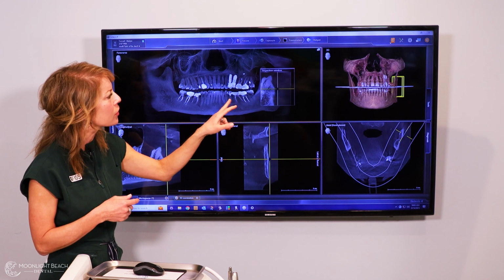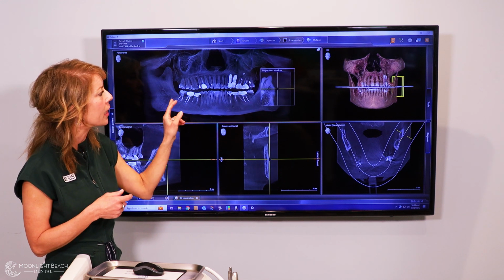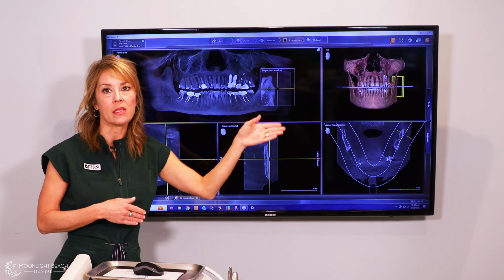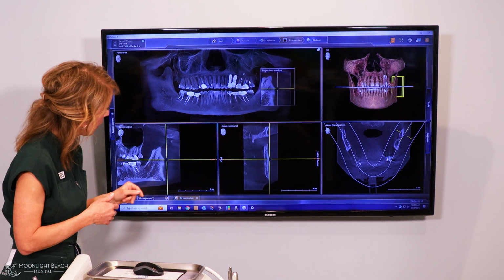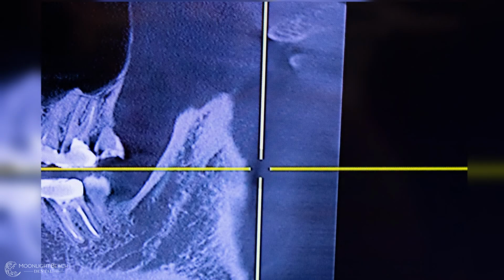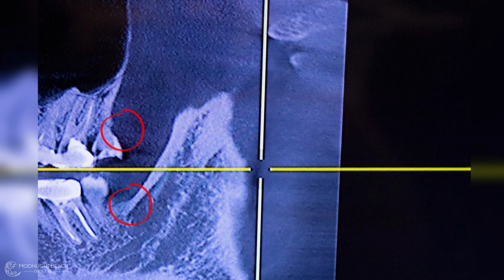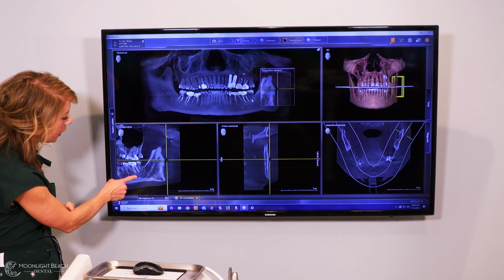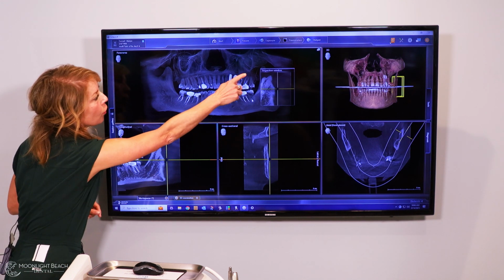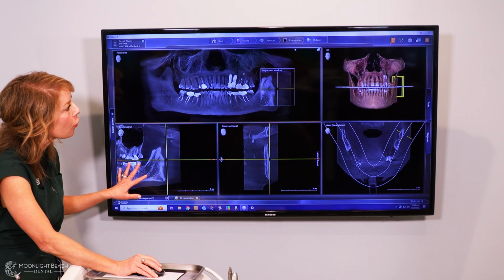The other thing I noticed was there was a lot of issues with the way her root canals were done, several teeth that were breaking because of her bite, and these are all things that we can see once we start evaluating the different slices of the 3D x-ray. When we went through some of these, I could see here how she had some big infection around, for instance, in this case, these two root canals that were in this field of view. And I could also see that this one was going into the lower jawbone and could be causing more problems down here, and that this one, the one with the sealer puff, could be causing issues in her sinus. So those are things that we look at when we scroll through.